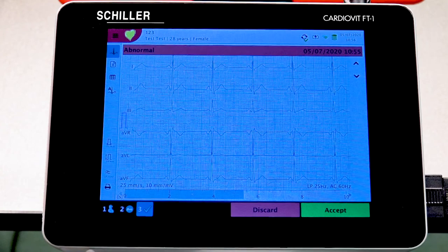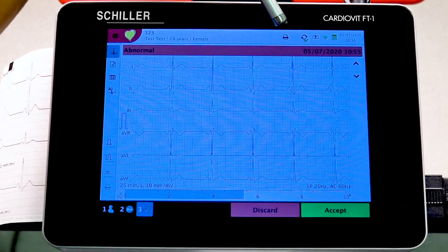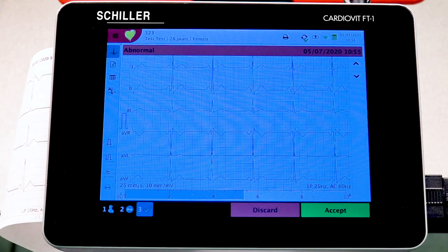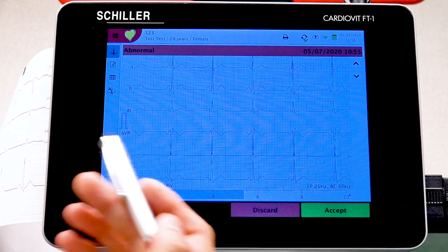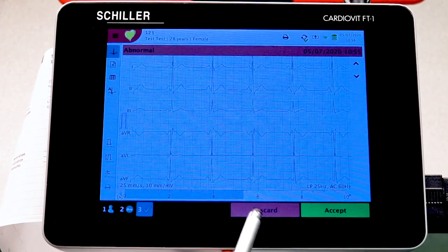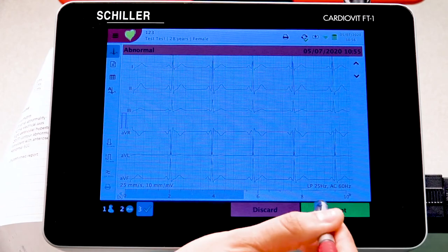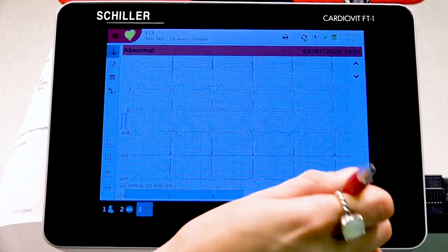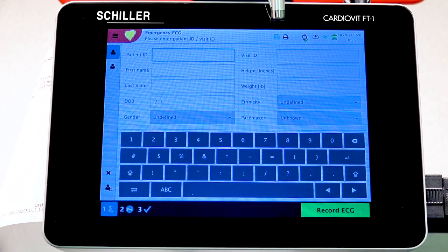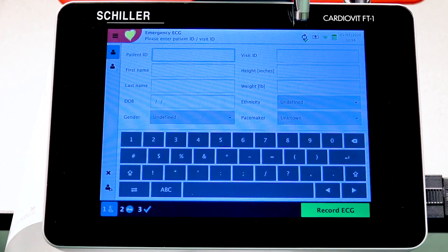Pressing the printer icon will have the internal printer print out the report, as indicated by the icon at the top. If the nurse or doctor decides the recording is not acceptable, they can discard it by pressing Discard. If it looks good, press Accept. After accepting, you'll see an icon confirming the report was saved to internal memory, and a green check mark confirming it was successfully transmitted to the server.